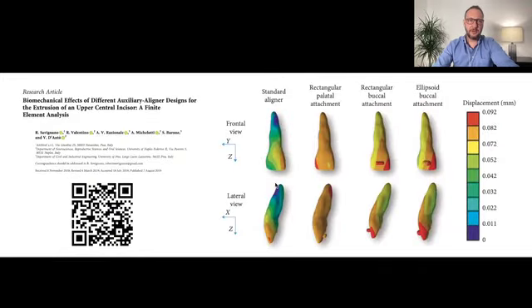Another study about attachments, when deciding, depending on the case, if we're going to bond on the lingual face or the buccal surface. These studies started changing my mind, because in the beginning I struggled to have good results, depending on the case, placing the attachments on the lingual side.